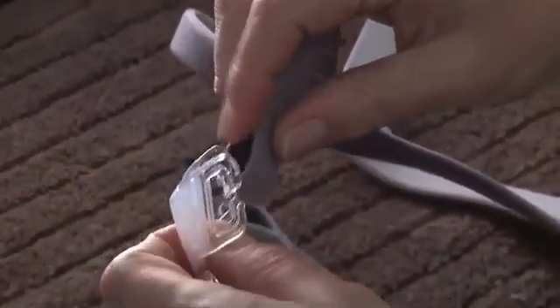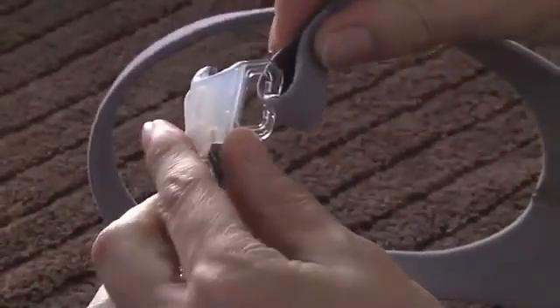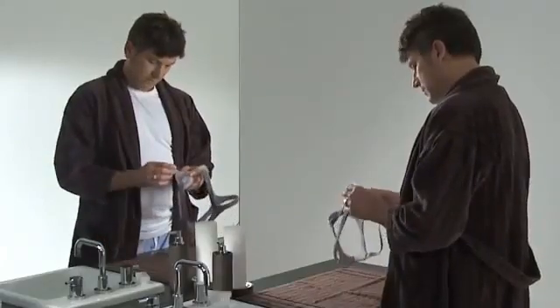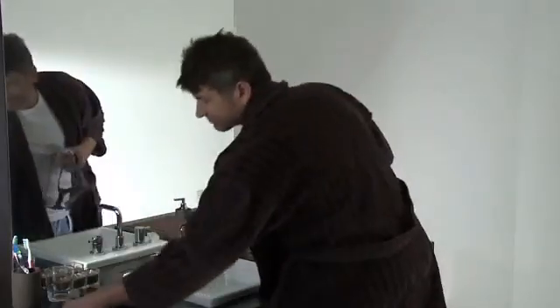Next, attach the top headgear straps to the frame by looping onto each of the upper headgear hooks, like this. Replace the elbow by pressing the side tabs and pushing into the mask. Your mask is now fully reassembled and ready for your next night of restful sleep.